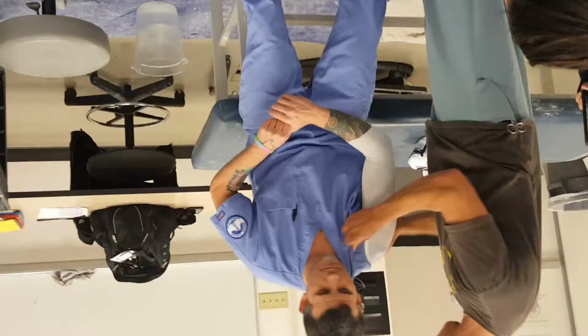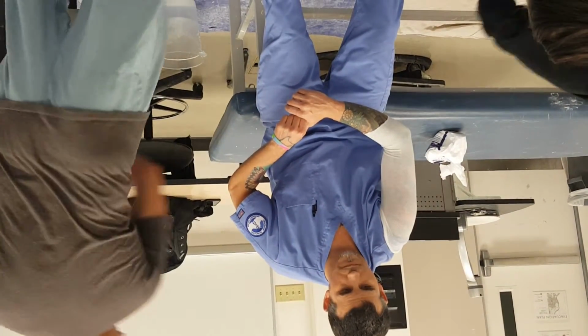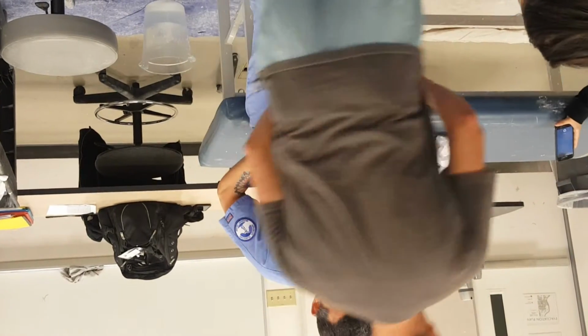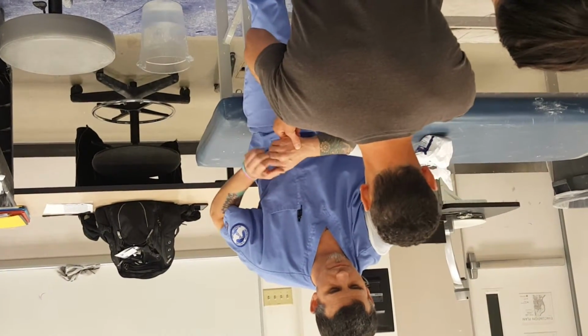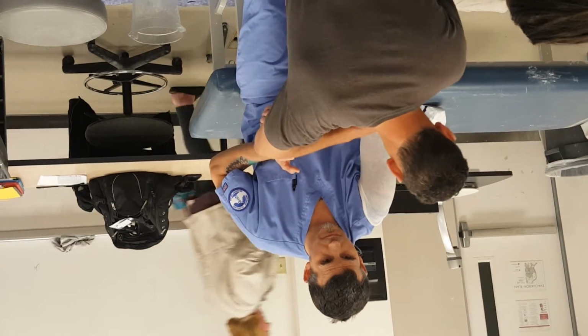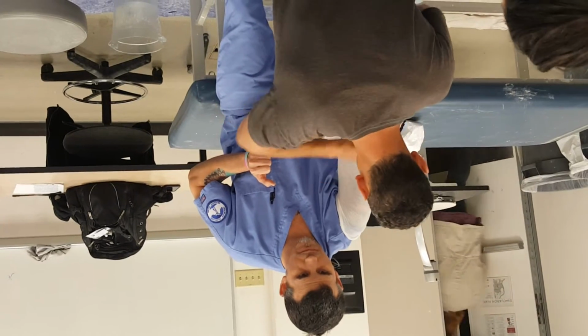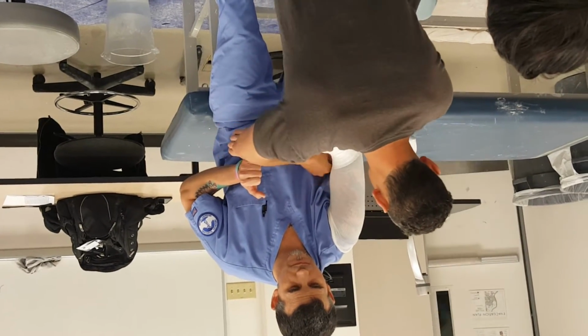Same as coaptation splint. What's your proximal parameter? AC. Very good. 90 degrees. Got it. Very thin on the padding. This is a 50% overlap all the way back up.